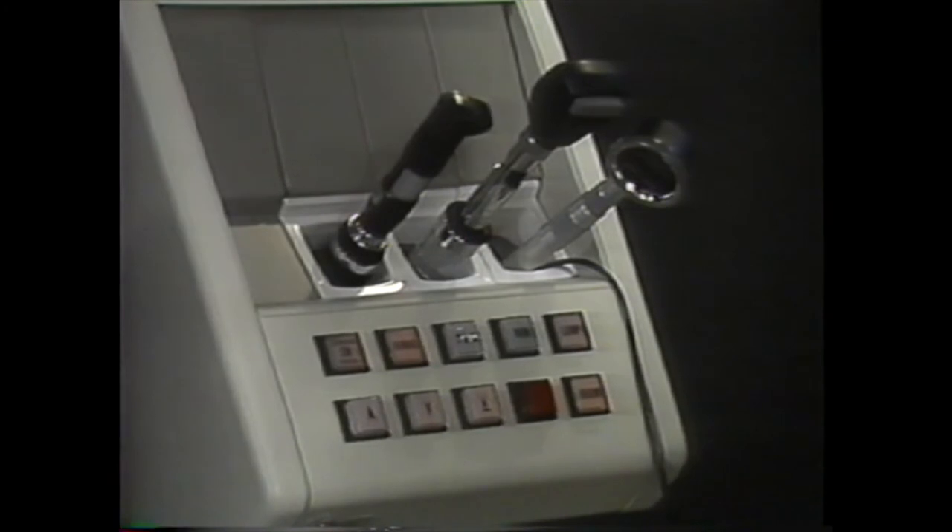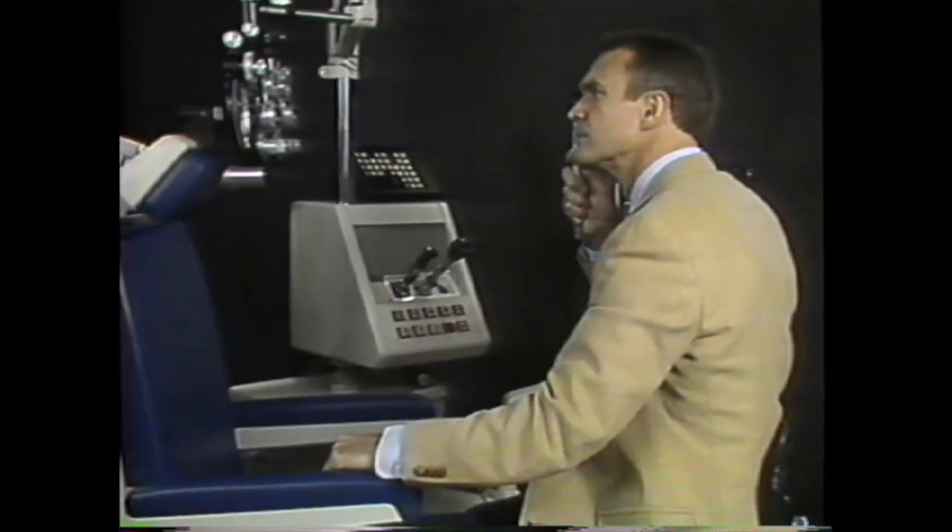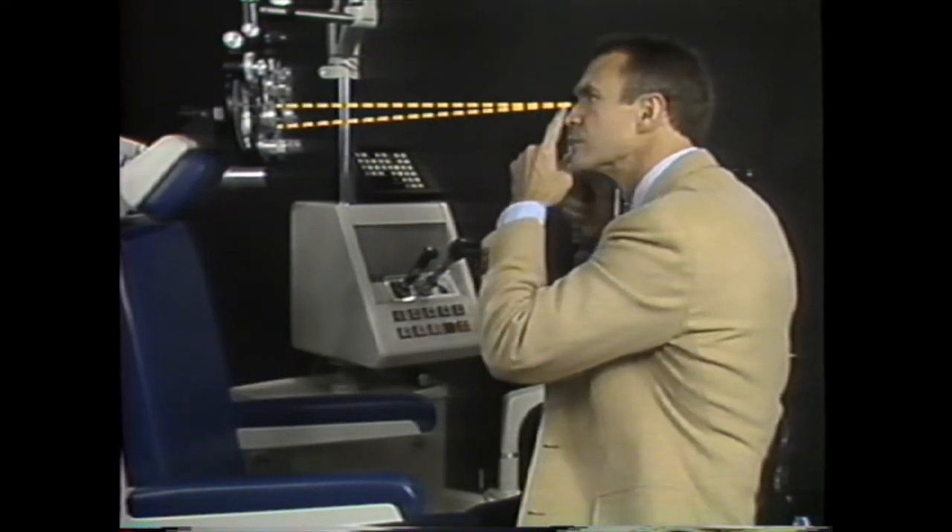Also note that except for clearing the cylinder power initially, we have not yet had to pay any attention to the actual sphere and cylinder powers in the phoropter. Instead, we know which way to turn the dials and knobs by the type of reflex we see. The actual lens powers are not important until it comes time to record the results. You're not yet ready to record the results, or even to move on to subjective refinement with a patient, for the eye's far point is still at the working distance.